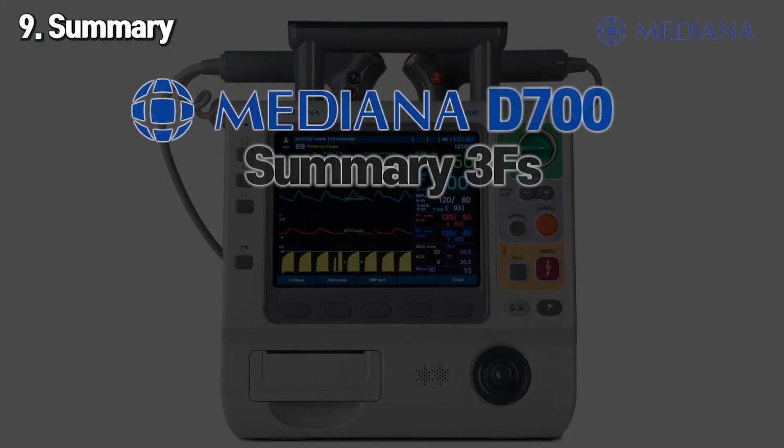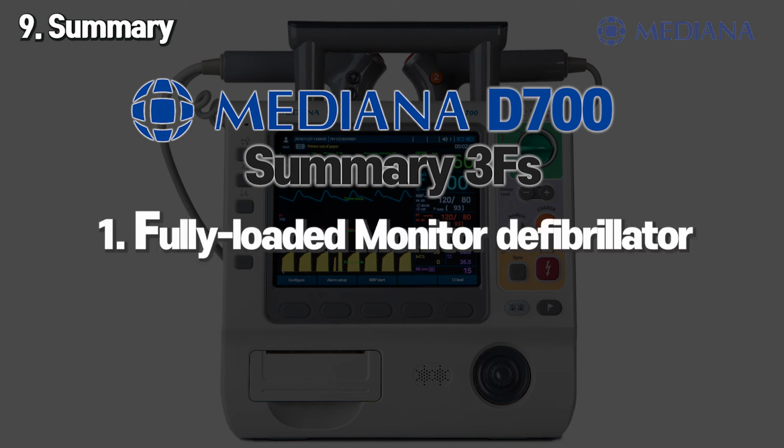We can summarize D700 by 3 key points. We call it the 3 Fs, which is fully loaded monitor defibrillator, friendly user interface, for anywhere. As a fully loaded monitor defibrillator, it has all the functions that it needs. It uses advanced biphasic technology which can deliver up to 360 joules. It has an all-in-one defibrillation mode including manual, AED, pacing, monitor, synchronized cardioversion, and internal defibrillation. For 12-lead ECG monitoring, we use the Glasgow algorithm.